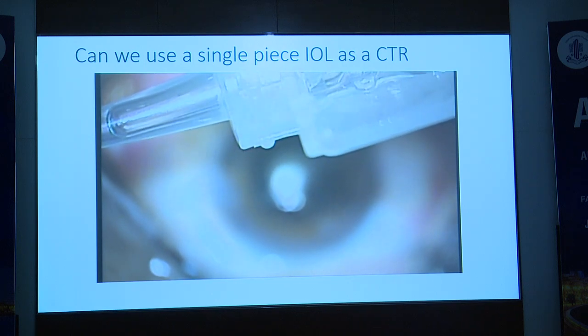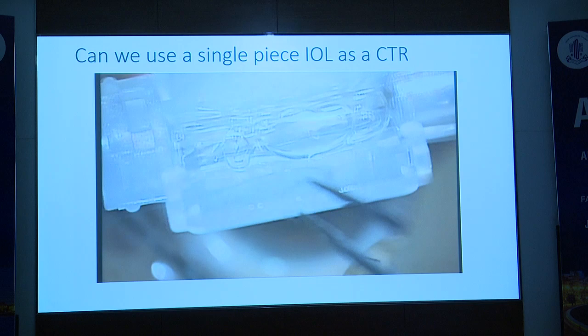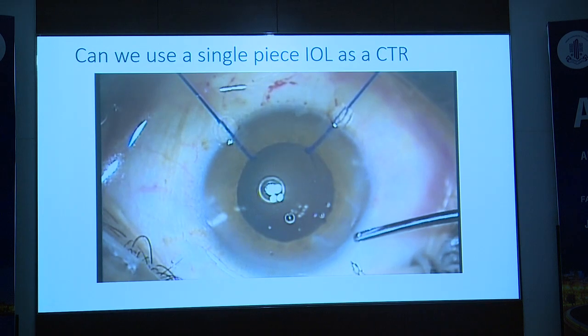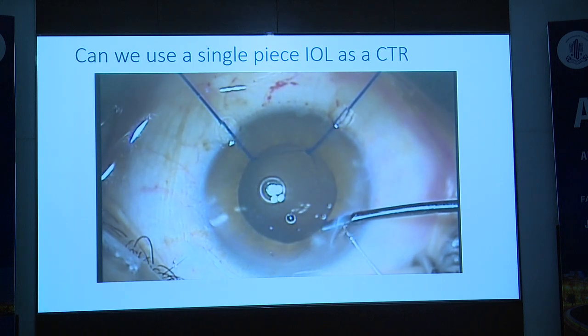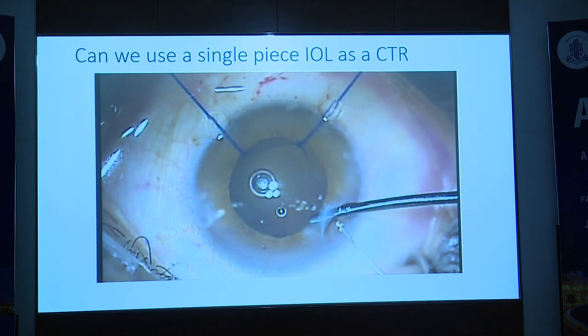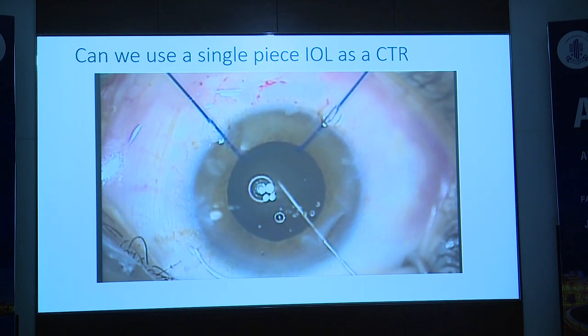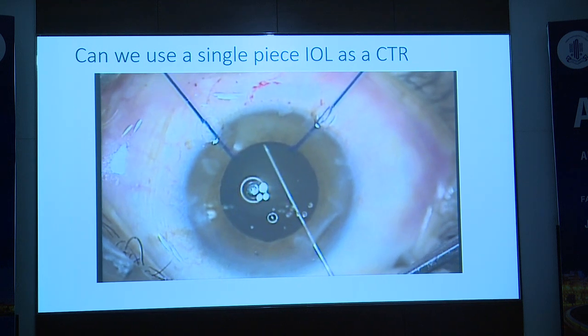This way you can use the same 2.8 tunnel and inject the lens inside, rather than having to do a scleral tunnel and use a PMMA lens. So now you have needle attached to suture, attached to leading haptic. In goes the needle. And then it should come out of the eye about 2 millimeters behind.